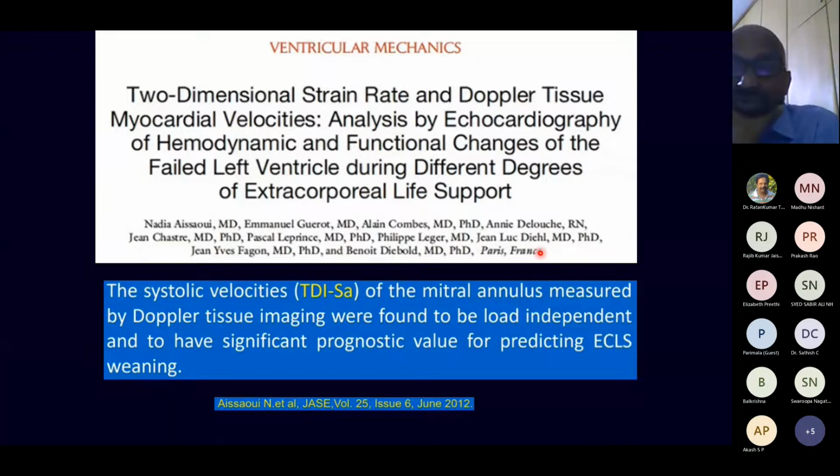In conclusion, the use of echocardiography is absolutely useful in all types of temporary mechanical circulatory devices. For example, starting from IABP to impeller to LVAD insertion to institution of ECMO. In all these situations, the use of echocardiography is extremely helpful.